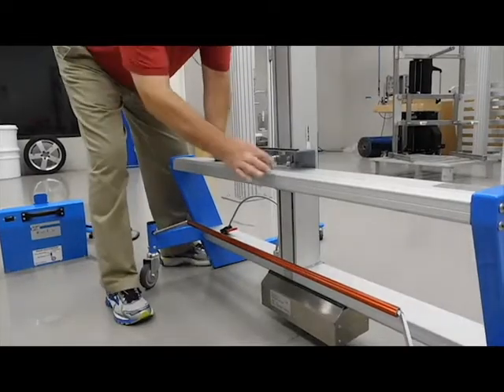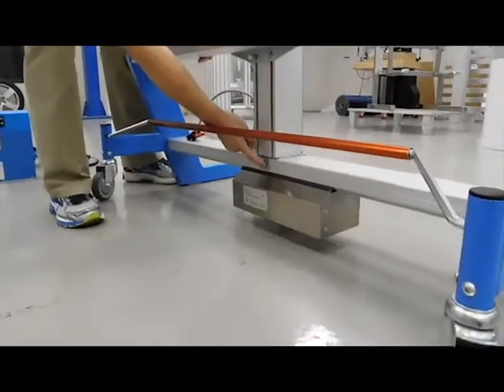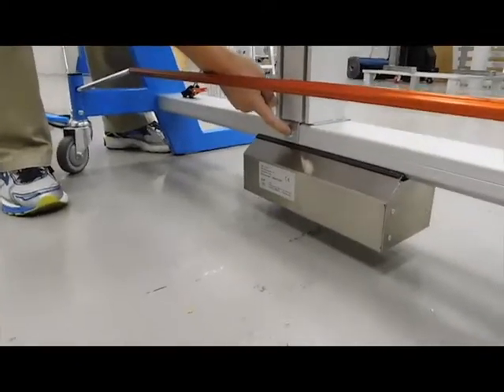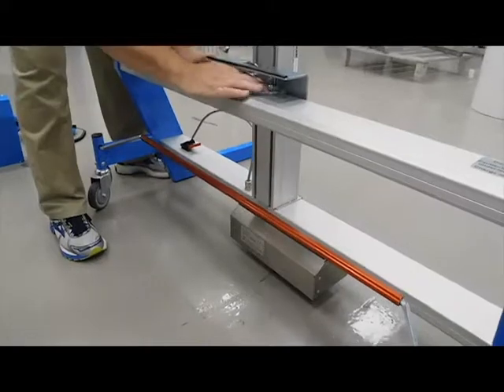Next, what he's going to do is he's going to go down to the lower intermediate. There's a 5 millimeter Allen here, 1 in here in the back, and there's going to be 2 in the front, and he's going to unloosen those next.